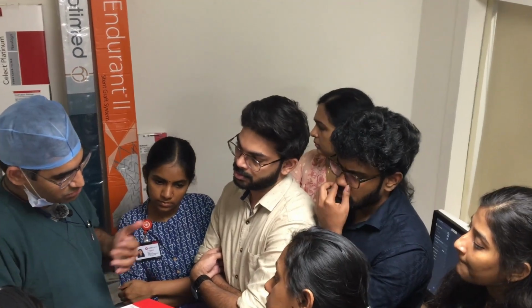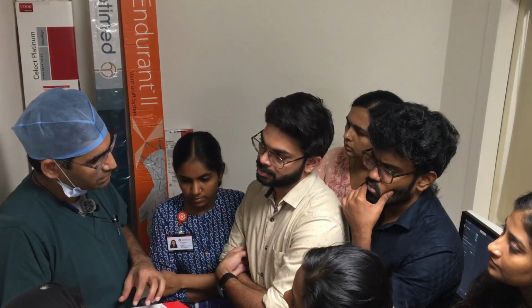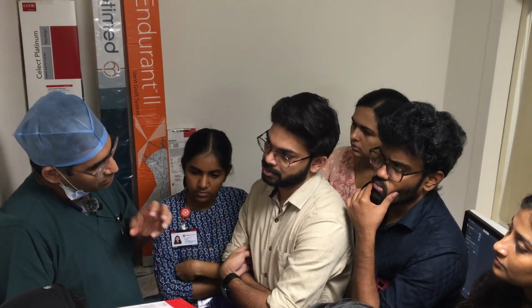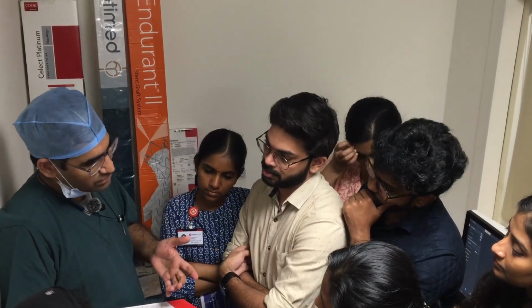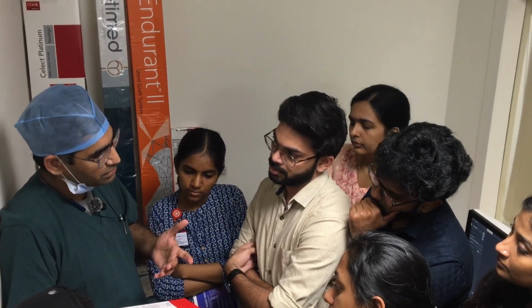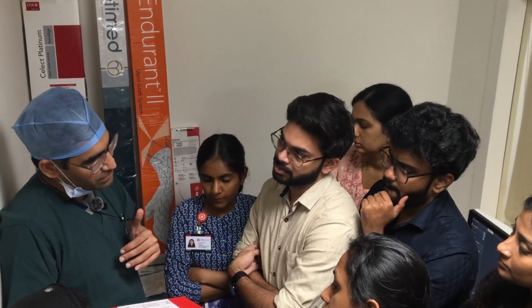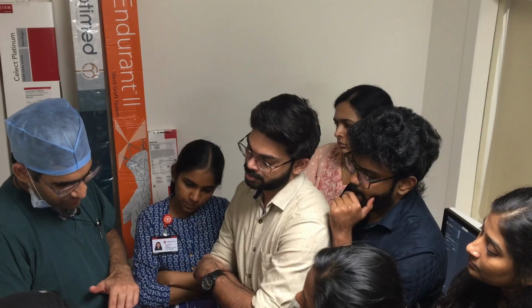So in those balloons, we don't need a pressure measurement. They are not pressure dependent. They are volume dependent. So with more volume, it will keep on enlarging. These balloons used for angioplasty are pressure dependent. So as you go to the pressure, it will go to the design predefined size. If you increase the pressure, it slightly increases.